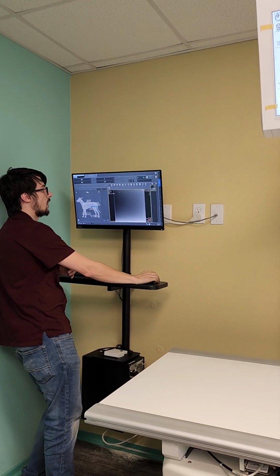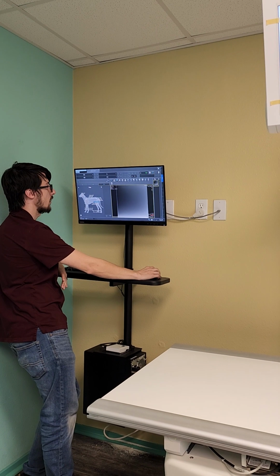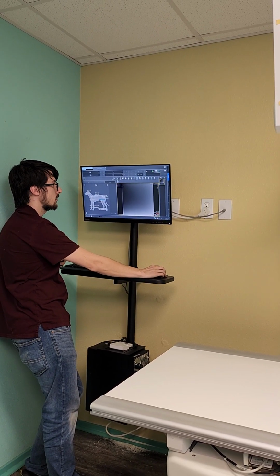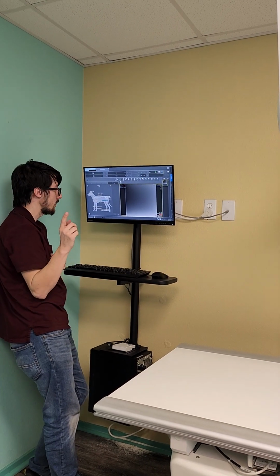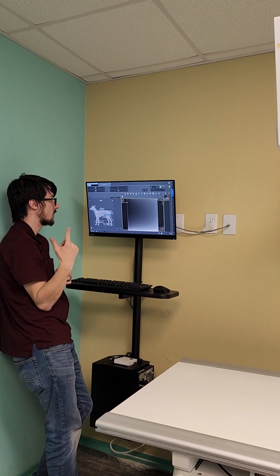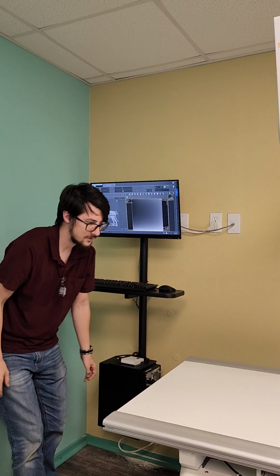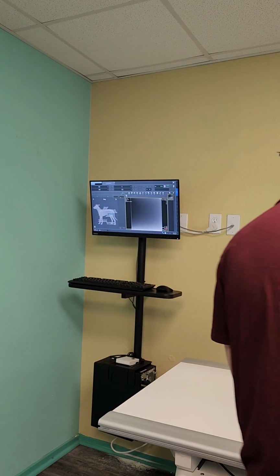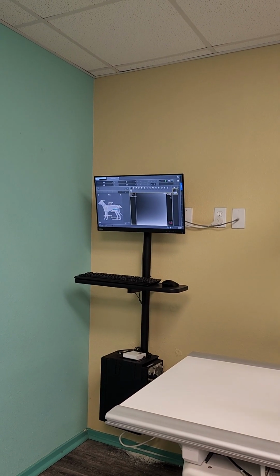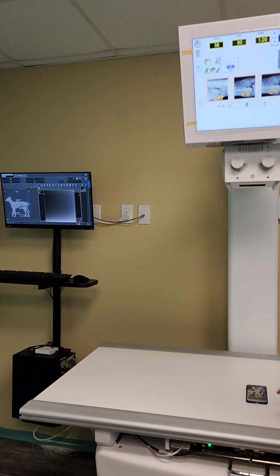Basically, you've got your left and right markers, so put it up at the top, left, right, and so on. Flip it, mirror it, counterclockwise. I actually need to flip the image right now, because that reminded me. Right now the images are upside down, so if I were to put my phone here facing straight, then the image on there would be upside down. I'm going to flip it in the settings, so y'all don't have to keep flipping the image around every time.